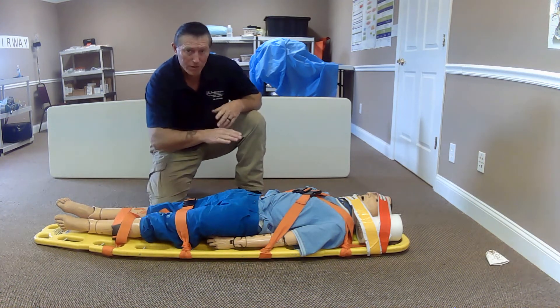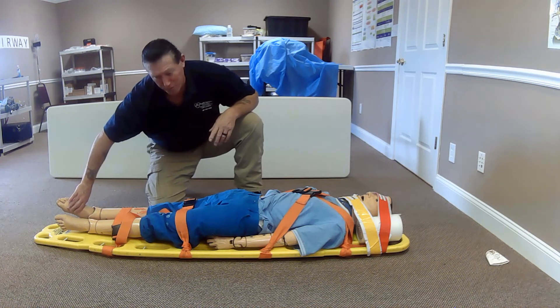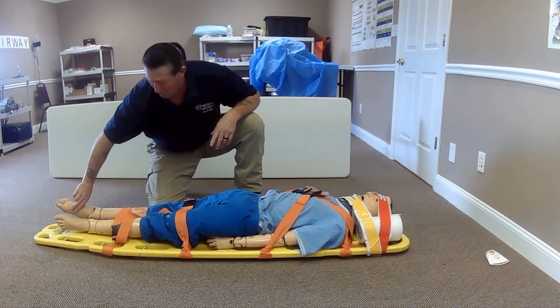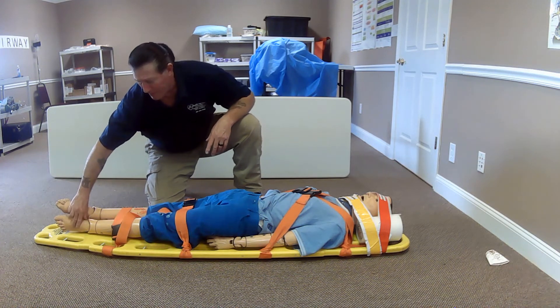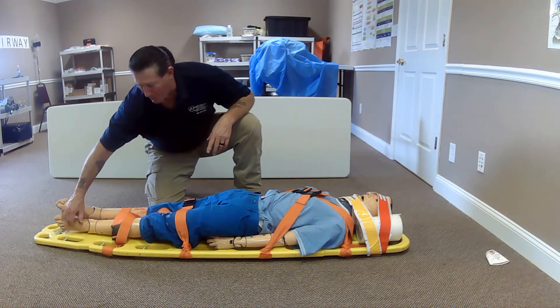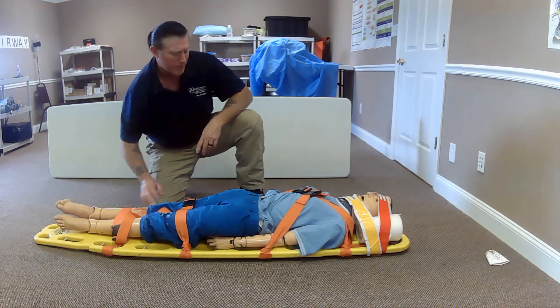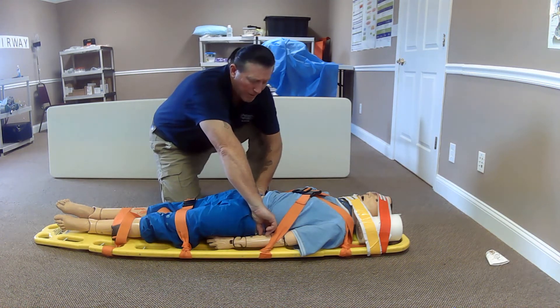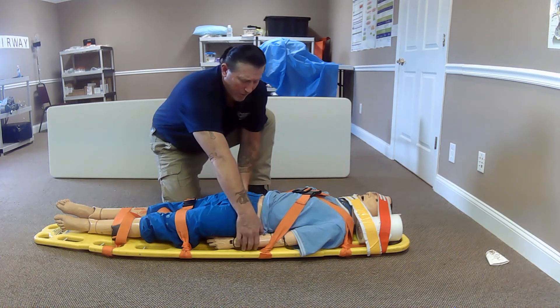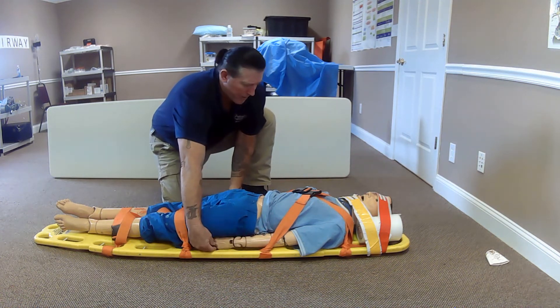I will reassess my pulses. I'm going to check the distal pulses since we are already down here — reconfirm I have my pedal pulses. Can you move your foot? Which toe am I touching? Pedal pulses on the left side — present. Can you move your foot? Which toe am I touching? Reassessing my radial pulses — present. Can you move your hands? Which fingers am I touching?